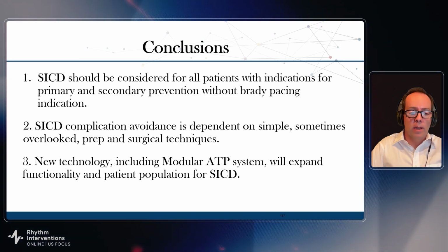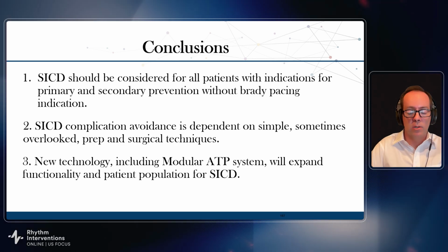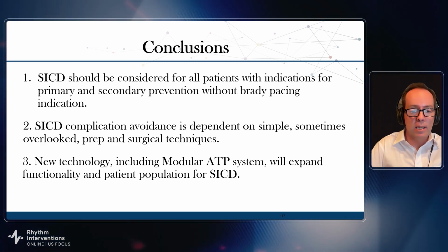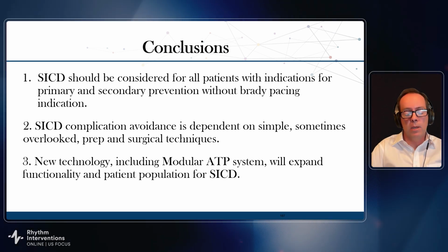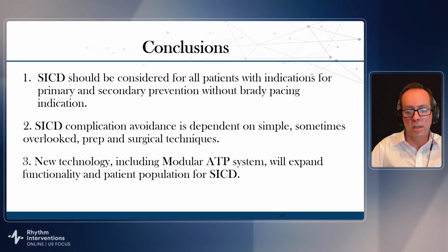I also want to emphasize that SICD complication avoidance is dependent on simple steps. The details will kill you, and I've been burned by this. Spend more time on the prep than your other implants and certainly the ablations, and that will make the surgery easier. And finally, the newer technology, this modular ATP system, may expand the functionality and the patient population for SICD so that you can temporarily brady pace and deliver ATP.